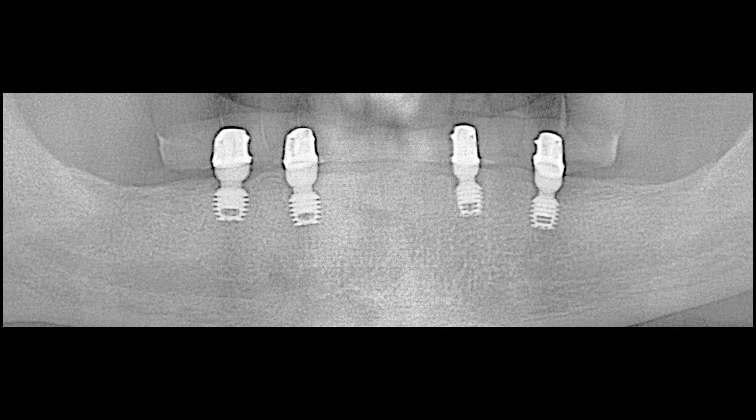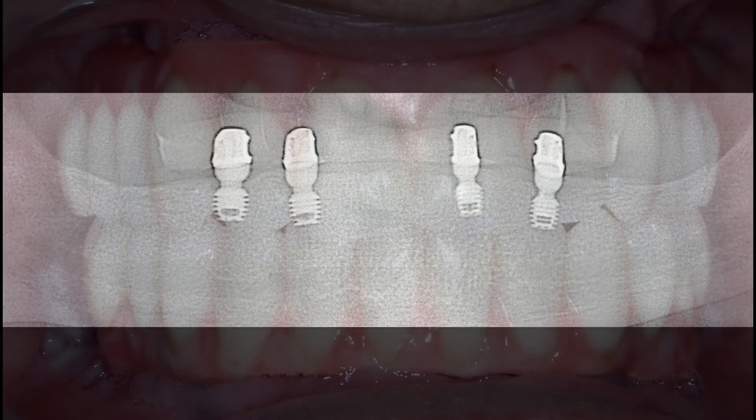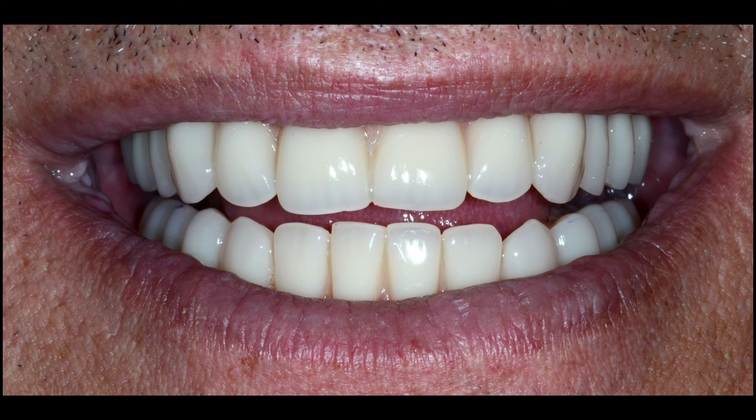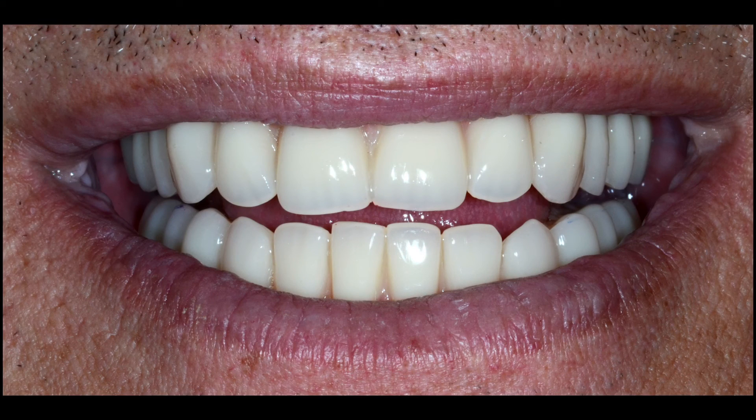A radiographic and clinical evaluation was made after removal of any extraneous cement. Upon confirmation of both the aesthetics and function of the prostheses, the patient was given instructions about the use, maintenance, and enjoyment of his new maxillary and mandibular telescopic TRINIA prostheses. Hopefully this video has enhanced your understanding of both the clinical and laboratory techniques which will allow you to provide telescopic prostheses for your patients in only three restorative visits.